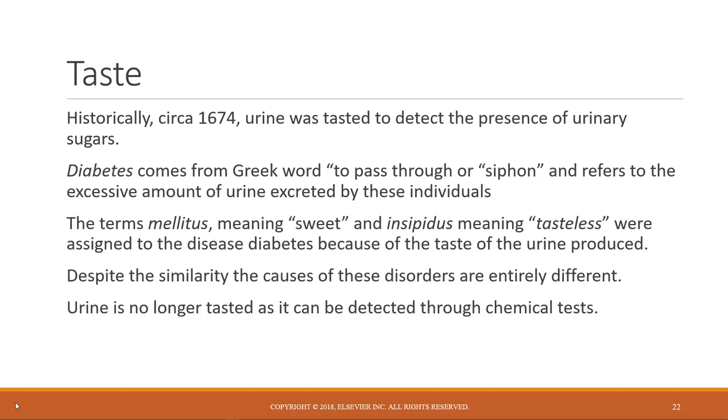Urine is no longer tasted. Aren't you really happy about that? Because glucose can be detected through chemical tests.